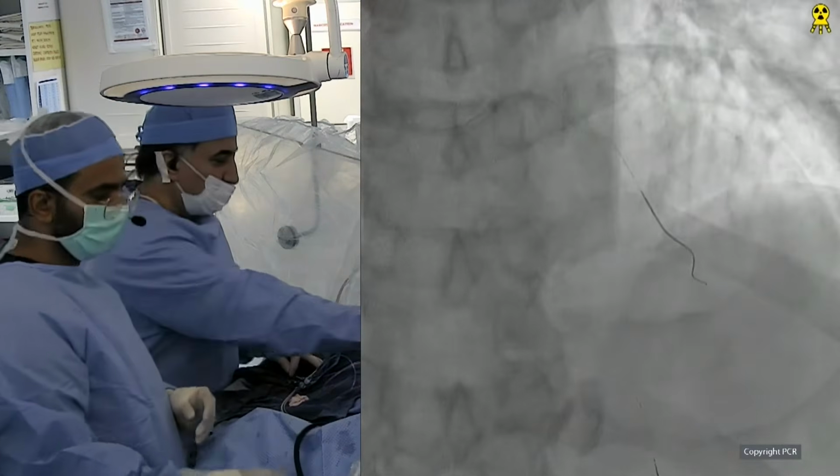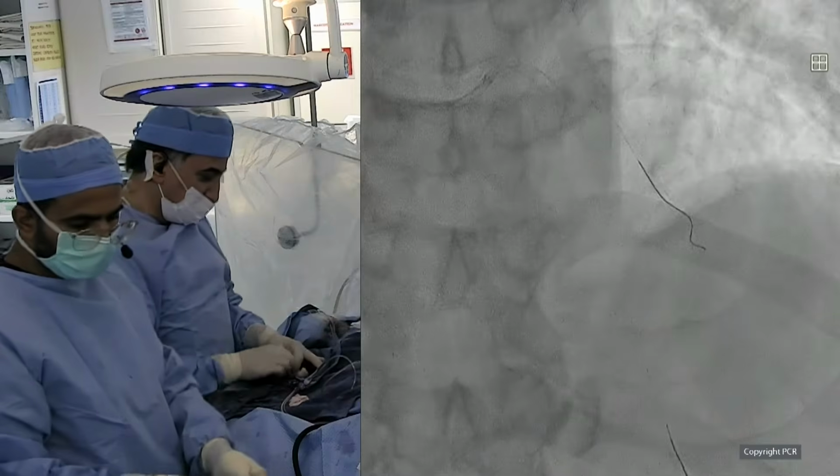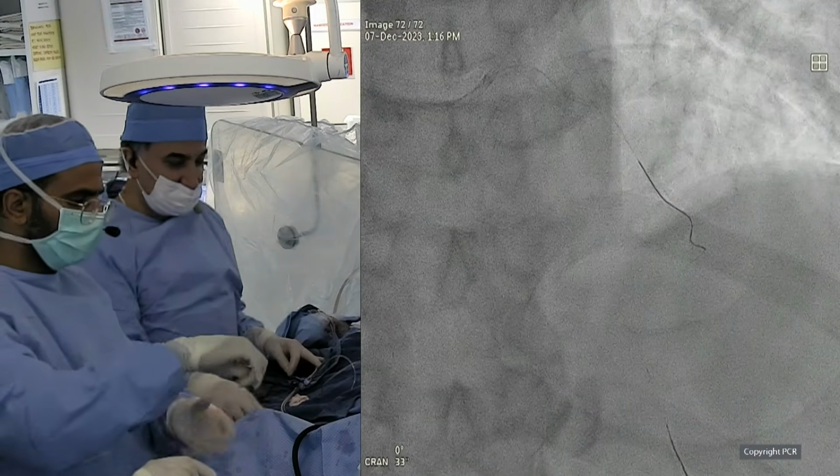Okay, give me the stent, please. We'll go first with a 2.75 by 38 stent distally.